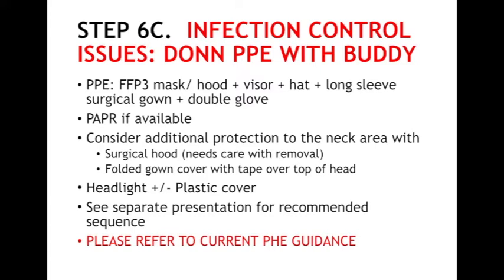It may be necessary for additional gown and gloves for staff touching the patient prior to the sterile field being prepared. If powered air purifying respirators are available, then they will be the equipment of choice. However, we have developed this protocol for when they may not be available.